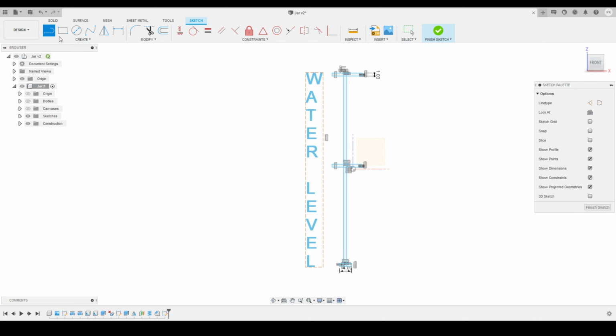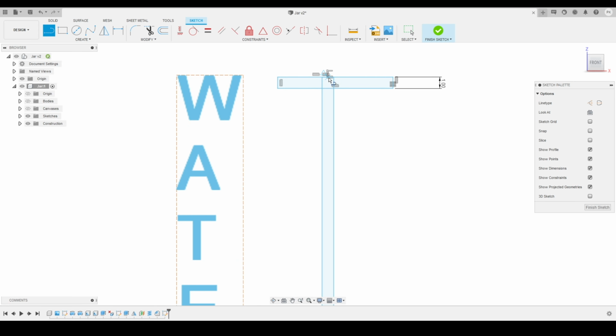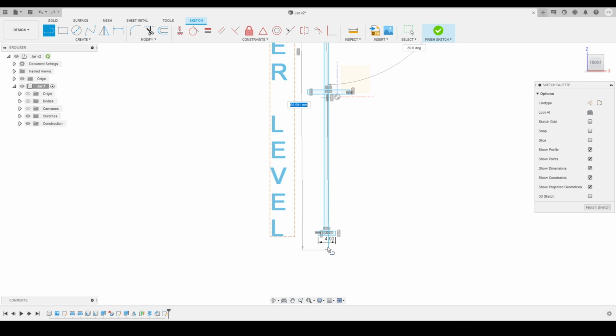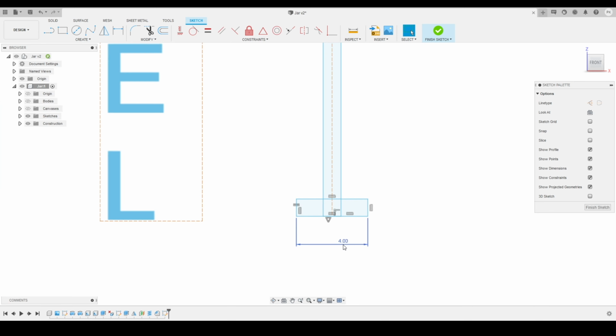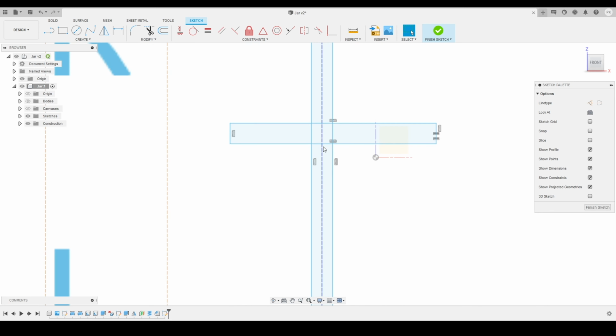Before that, I will just activate my line tool and we'll draw a center line like this. Here you can see, and we'll change that to a construction line. Here you can see I had created a line. Then we'll make sure that these are all midpoints and we'll change that to a construction line, and we'll do the same for this one as well.